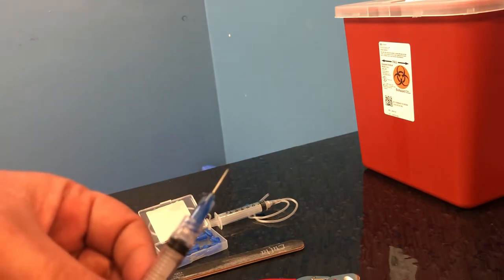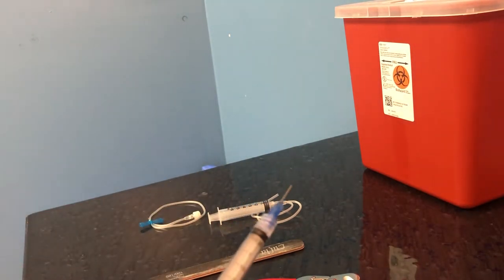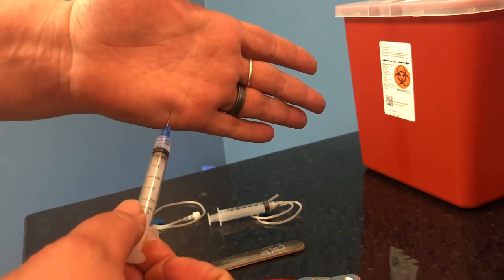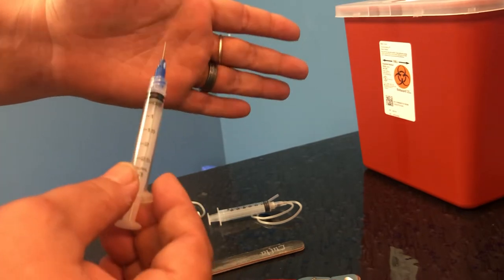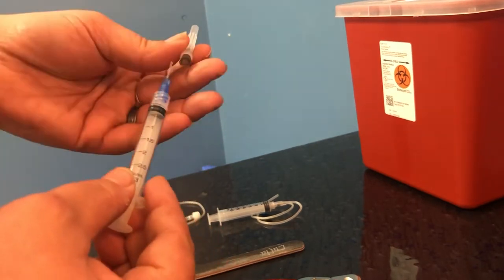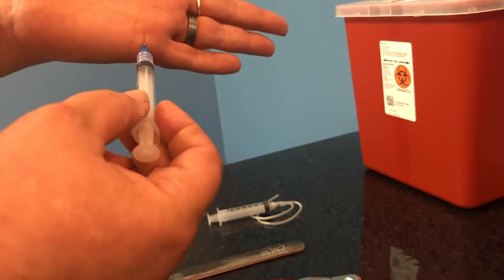What this is, is a needle that has a blunt tip, so it is not beveled, and it's not going to be able to pierce the skin when we are using it to work with an animal. I'll show you with my hand. You can see how much smaller surface area of my skin is displaced by this. That means it's a sharper stimulus when we apply it, and it's gonna more closely replicate the feeling that an animal might receive from an actual needle when we compare it to something like a capped needle, where it's a pretty blunt stimulus that doesn't really replicate an injection very well.